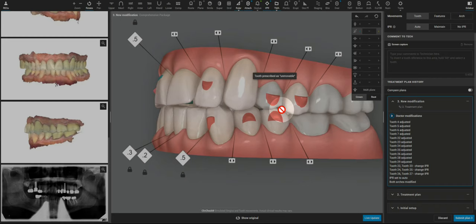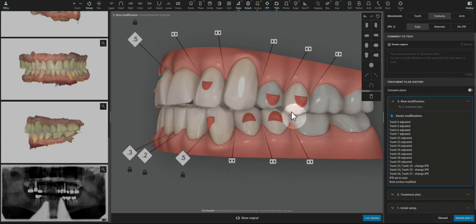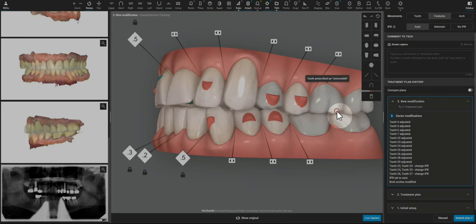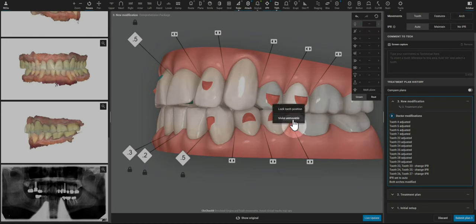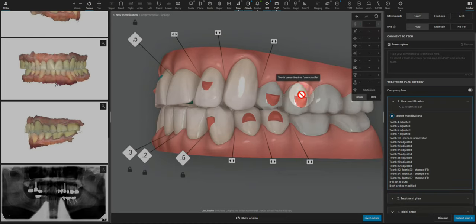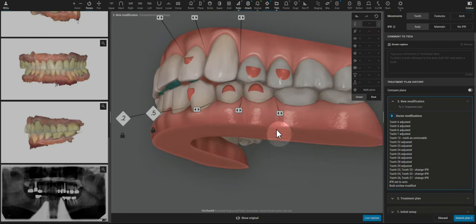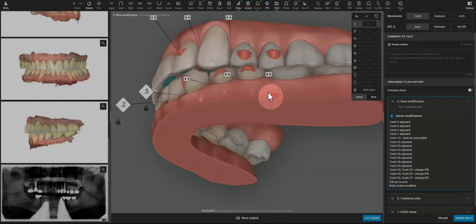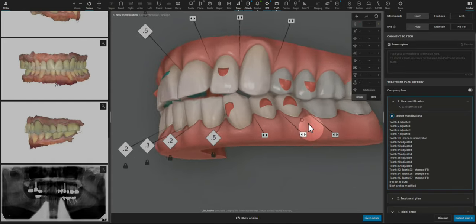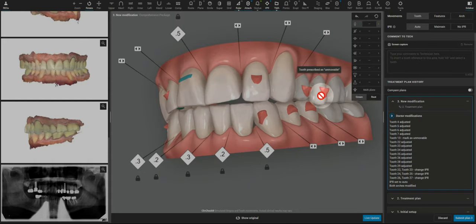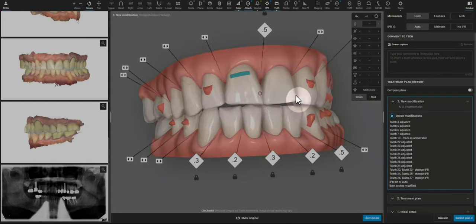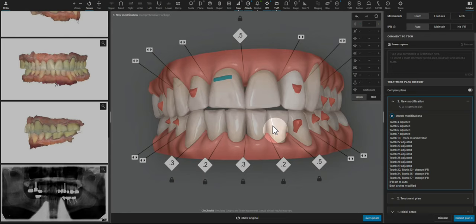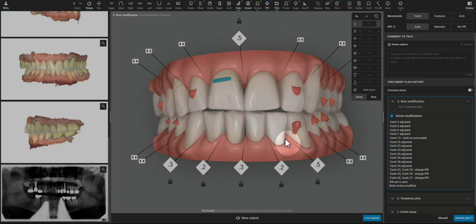Because this is an implant, we certainly can still keep that attachment and we'd want to keep that retention attachment, but now I can say might as well not even try to move the adjacent premolar because it probably already has some good contact points and that will just increase our anchorage and predictability of the other teeth.